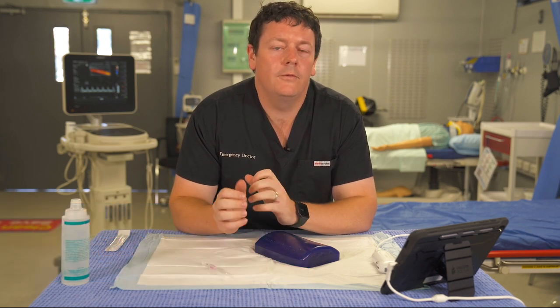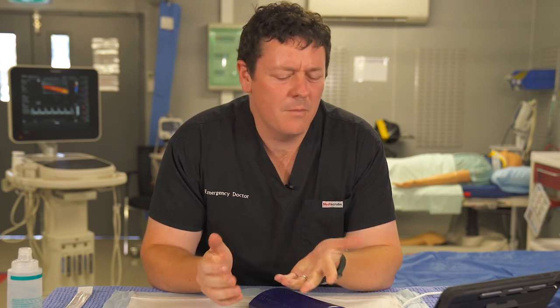Today we've got our Lumify set up with our vascular probe, and we're looking at the two techniques — in-plane and out-of-plane — specifically following our needle to a target. This is one of the most useful skills in ultrasound for point-of-care use, particularly in the emergency department, where common procedures include vascular access, needle-guided nerve blocks, and peripheral or central access.